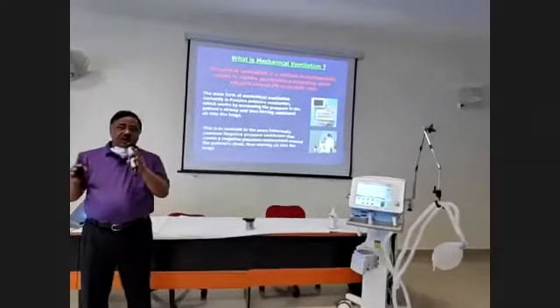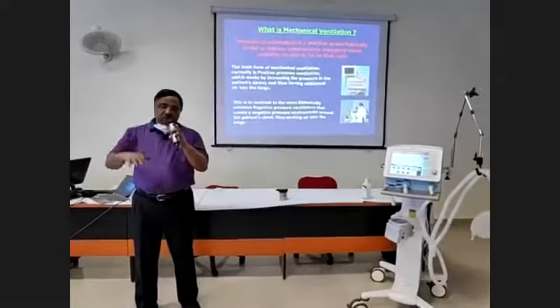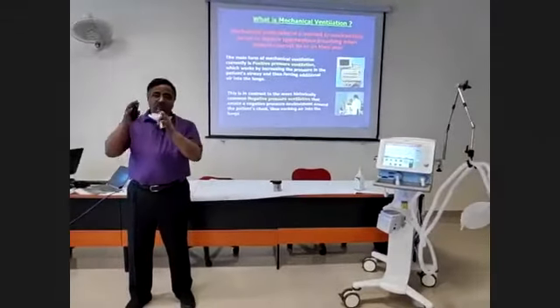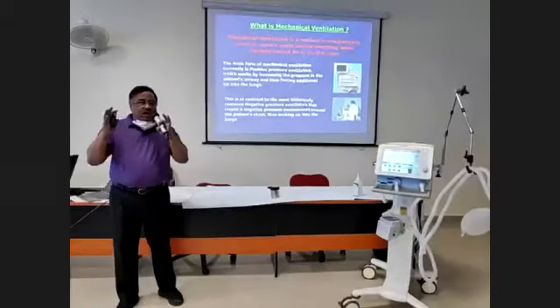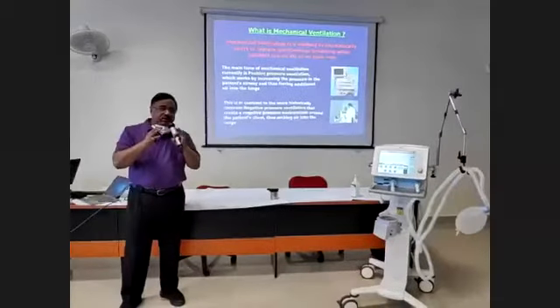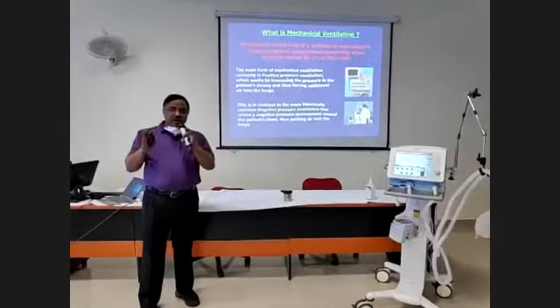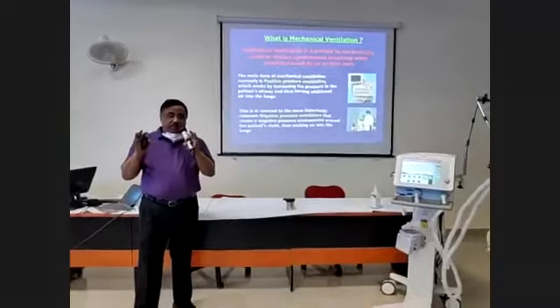A human being is breathing, he may breathe at a higher rate, at a lower rate, or at whatever alternate rate. The ventilator has to adjust. If these two things don't synchronize properly, then there will be a very high level of asynchrony, and that will go on increasing the work of breathing of that patient. Finally that patient will get exhausted, and ultimately the outcome is that the patient may die.